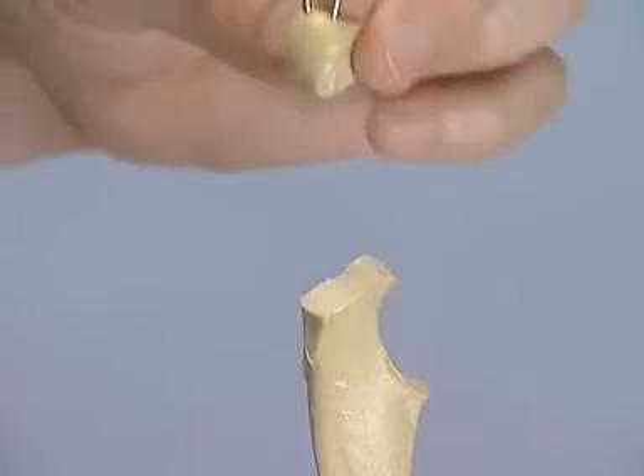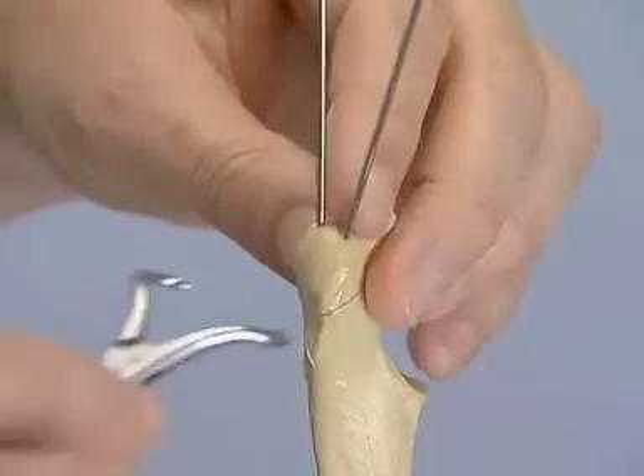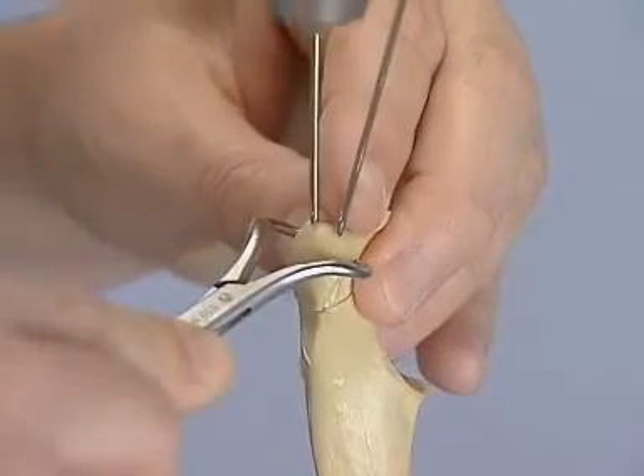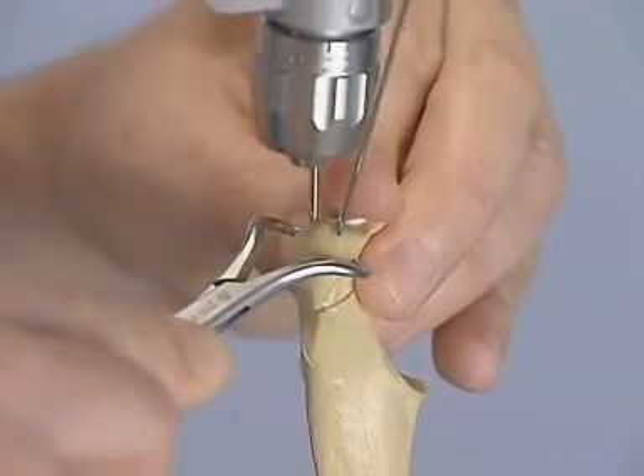Reduce the fracture and hold the proximal fragment with the pointed reduction forceps. Advance the K-wires into the shaft of the distal fragment.